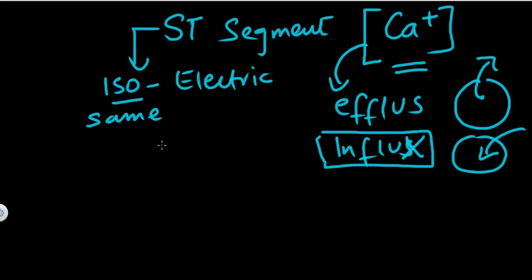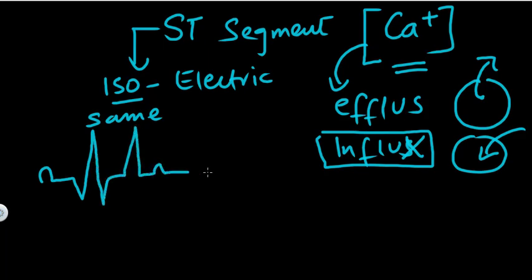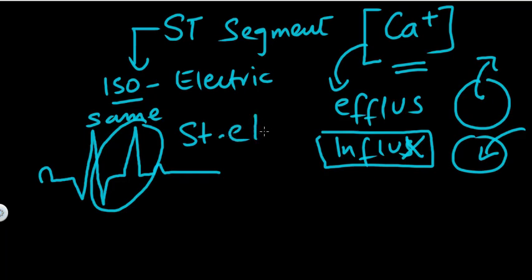Now remember this, that whenever you see something like this one here before the T wave, this is basically your ST elevation or ST segment elevation.